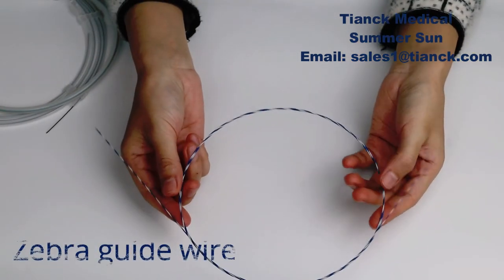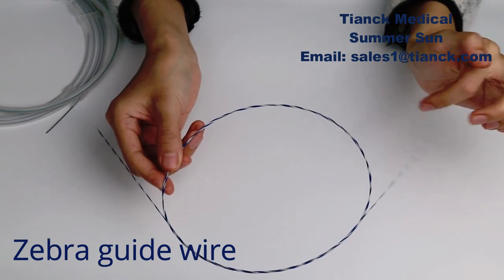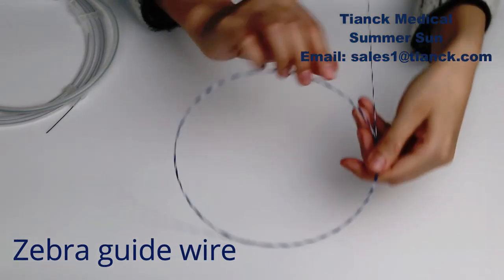Hydrophilic zebra guide wire — the nickel titanium alloy material has reliable torsion control and pushability. The smooth and soft tip design reduces patient tissue trauma.